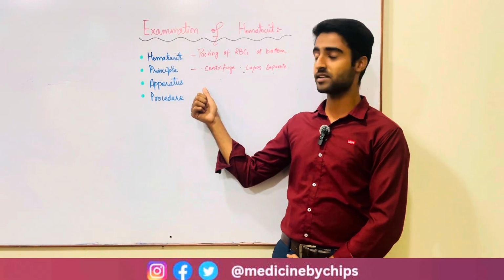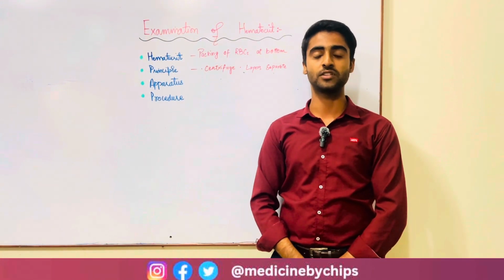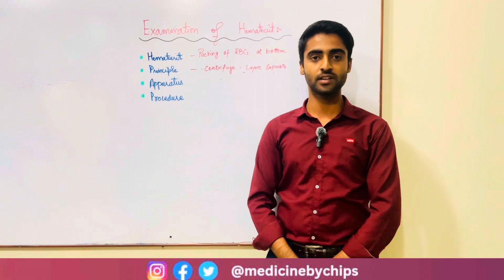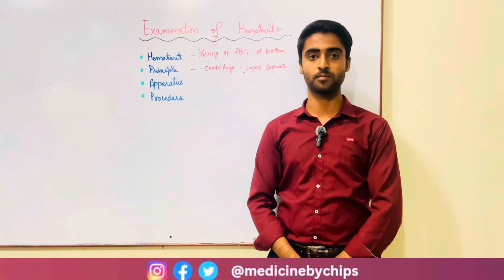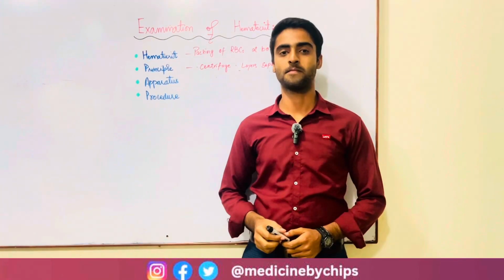Now we talk about the apparatus of this experiment. The apparatus used is a microhematocrit centrifuge machine, which is used for the centrifugation. We have a reader, and a sterilized lancet, which is used to prick the finger. We have an alcohol swab for cleaning the surface of the finger. And then we have the heparinized capillary tubes, which are used in this procedure.